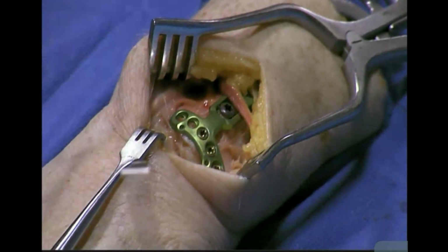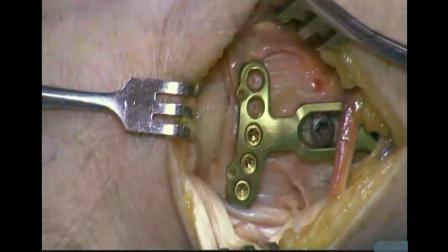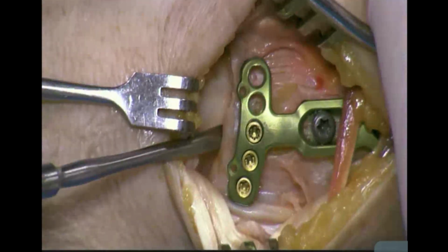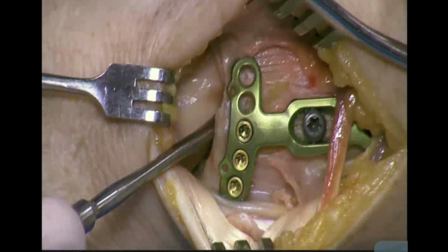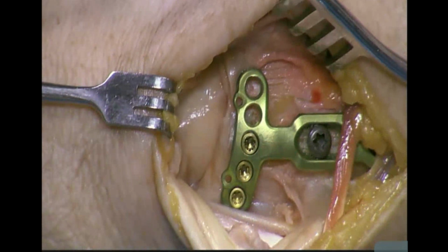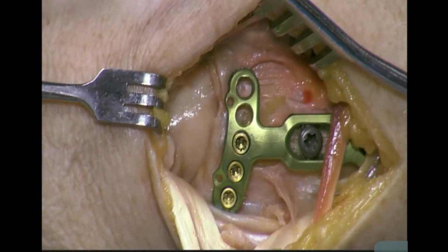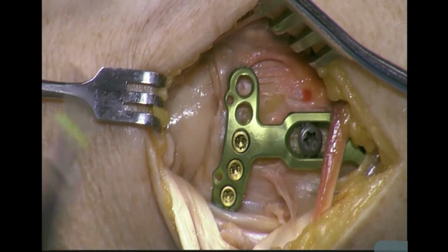I'm going to lock it down. And then the beauty of the dorsal approach, I don't need C-arm at all at this point. And if I'm worried about the joint surface or my comminuted fracture, I can always check it directly. And I've got no penetration. So looking good. We're going to move ulnarly and now use the variable angle type drill guide.